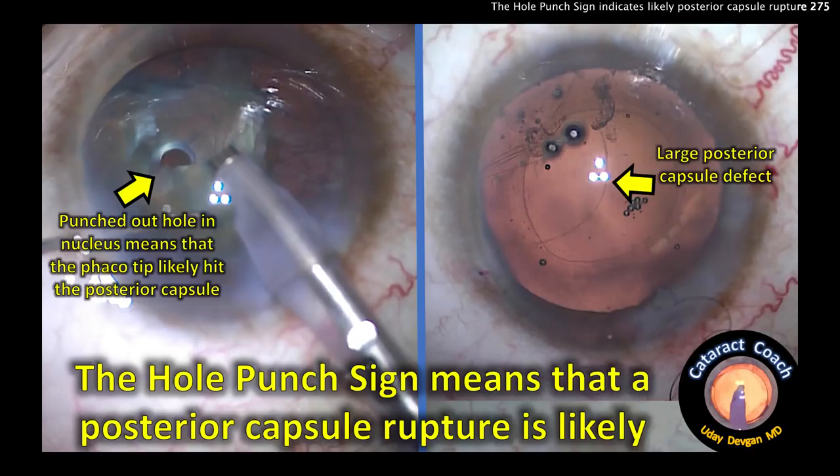This punched-out hole in the nucleus likely means that the phaco tip hit the posterior capsule.